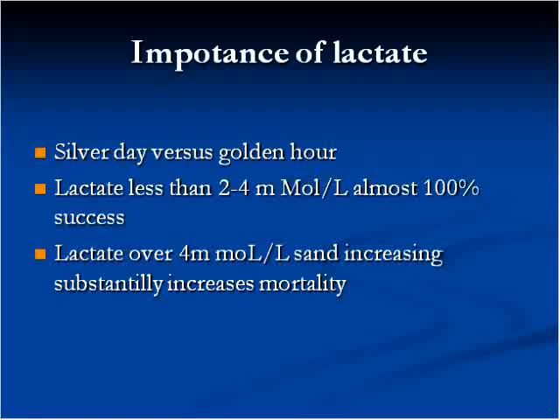So that ties together some of the reasons why on our point-of-care machines, these other analytes, lactate, glucose, creatinine, BUN, and various abnormal hemoglobin species we didn't talk about, can be very useful. My recommendation, and I guess my summary, is that I feel like blood gases are one of the best buys for the money.